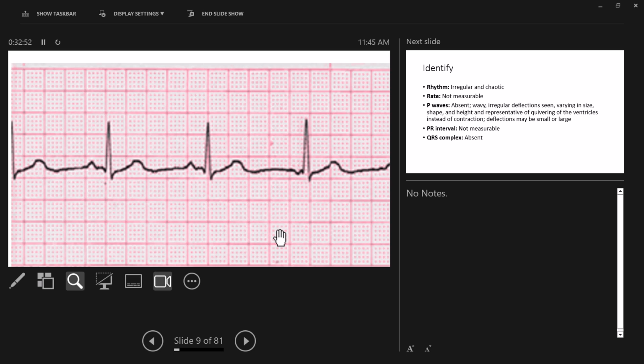If our P wave is down here, now guess what? It has to go up this way. That's going away from the positive lead, and as a result, that gives us an inverted P wave. Okay? Most of the time, not anything to be worried about, but within that right there, that is very important.